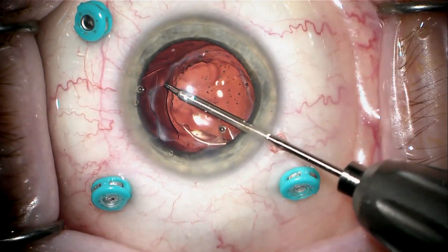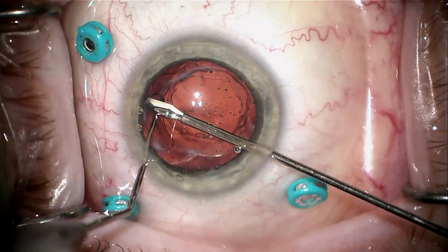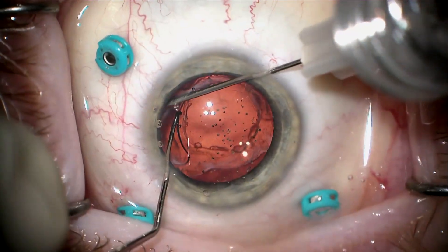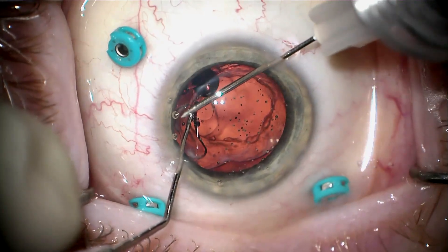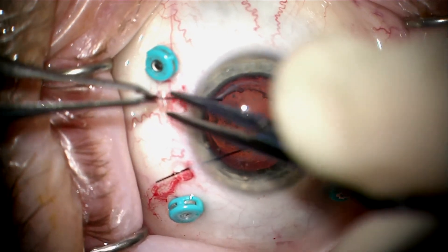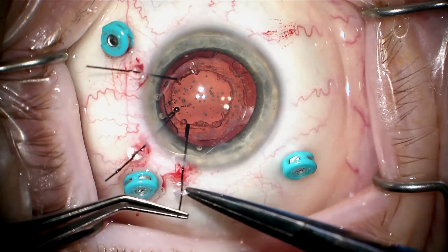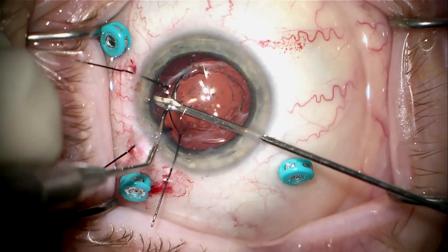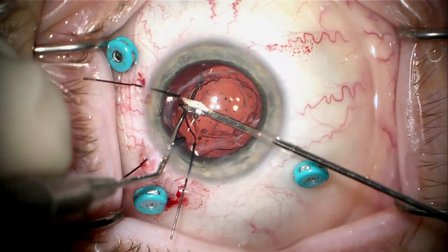Now I grab the haptic, and this lens is really socked in, so it's going to be a challenge to get it out. I'm going to retract the lens with a Sinski hook and use a micro-scissor to cut, and then I'm using a 27-gauge needle with viscoelastic to help with the dissection and sweep a little bit. I've decided to add iris retractors to stabilize the anterior capsule, and after placing these three retractors, I'm using a micro-scissor to help dissect some of this fibrosis away as I retract the lens with the Sinski hook.